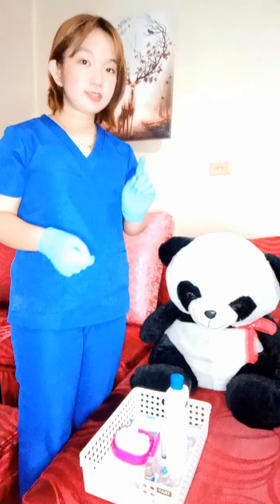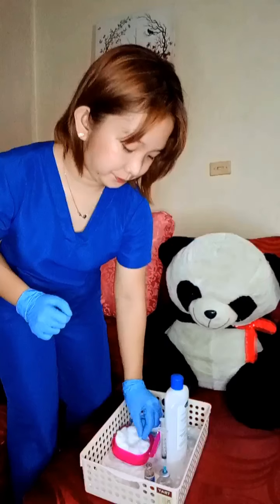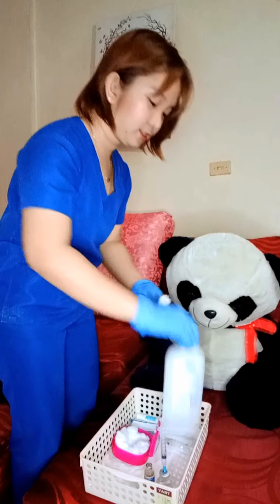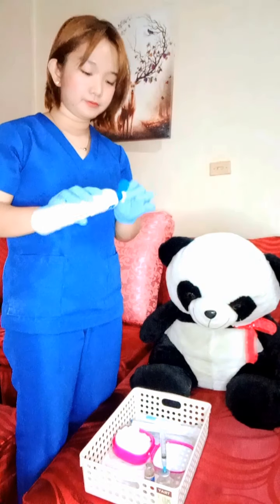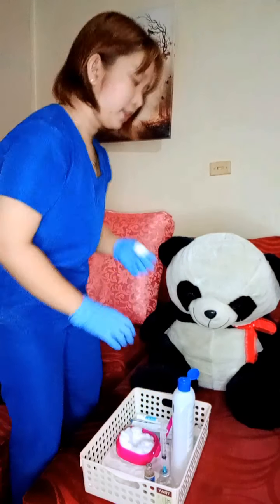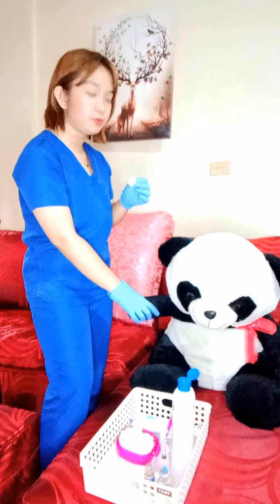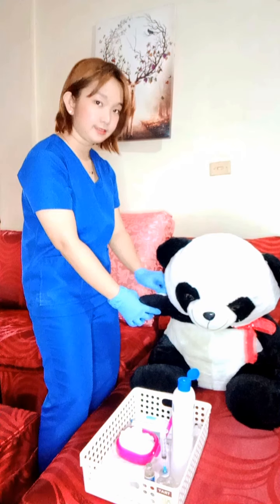First, get a clean cotton swab and put some alcohol on it. Get the location or the site where we're going to inject, and clean the site.